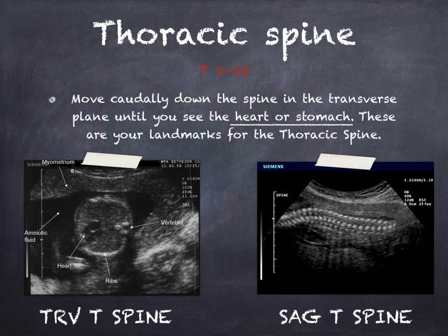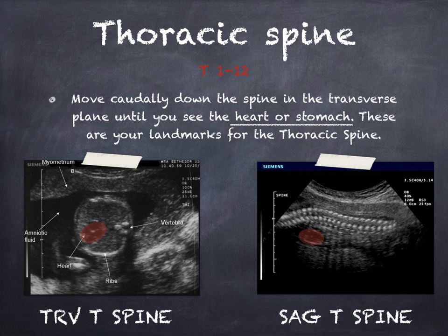Moving down from cervical, we reach the thoracic spine. The heart or the stomach can be your landmark for this view. If you see the kidneys, then you've gone too far — even the slightest movement could move you to the next spinal segment.